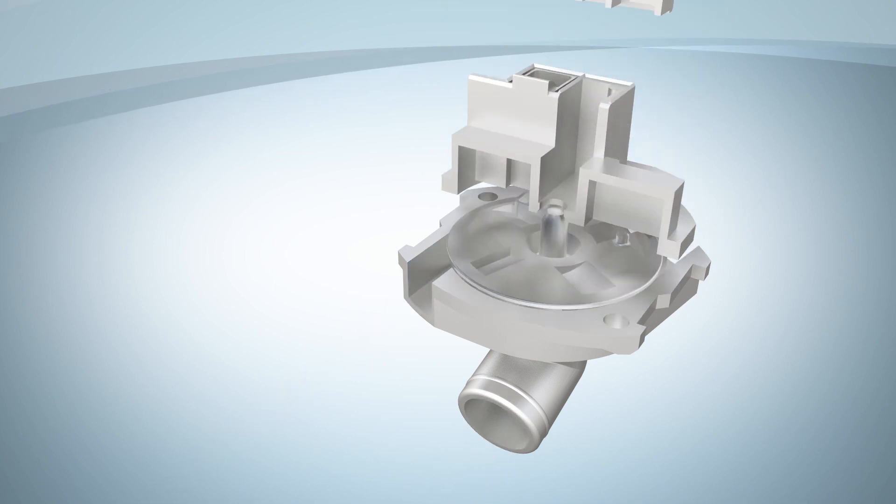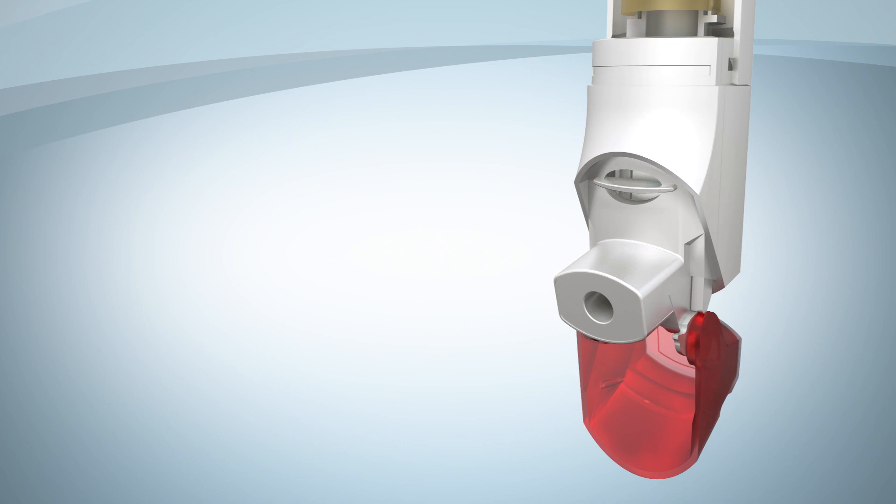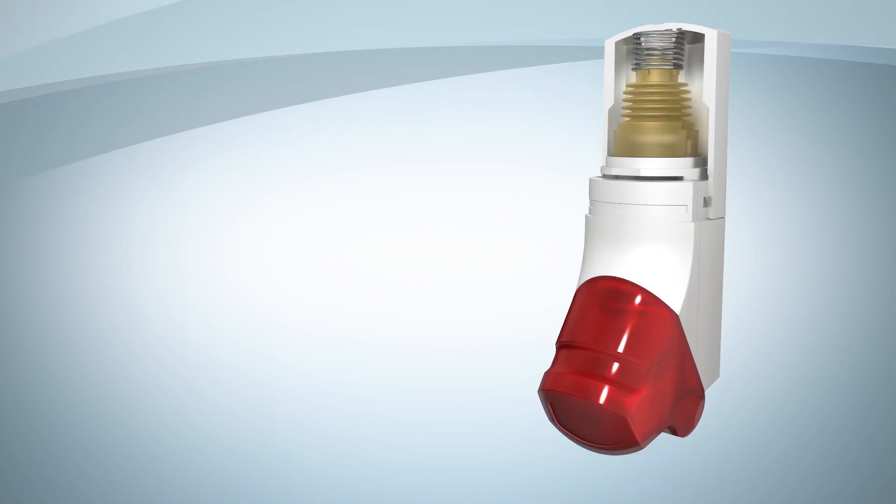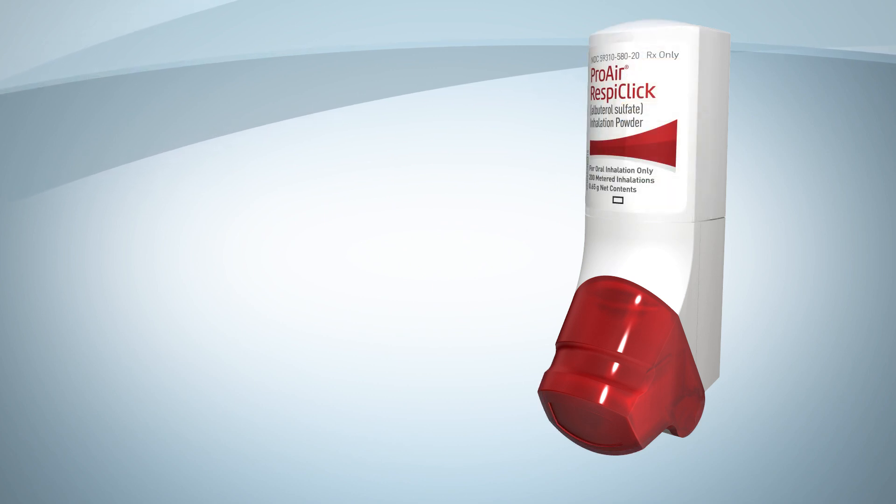Then, after you breathe in your dose and close the red cap, this pushes back the spring at the top, allowing the air pump to expand and resets the mechanism. So you're ready to load another dose whenever you need it.